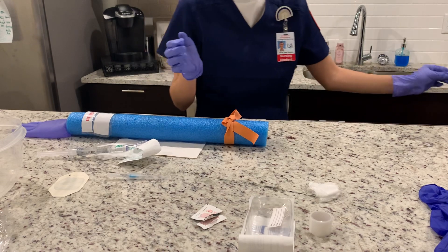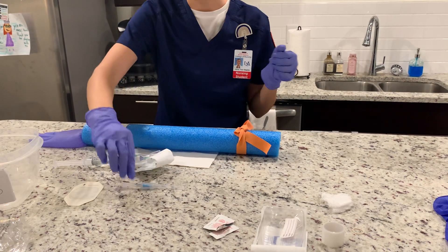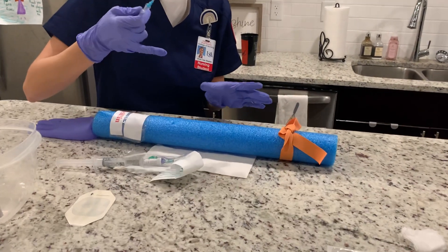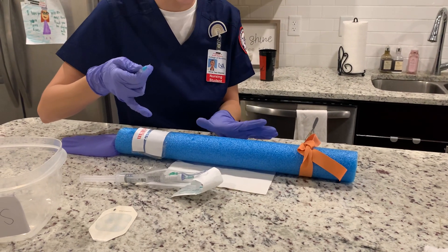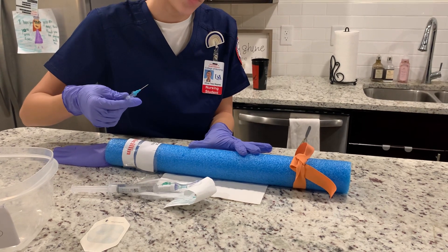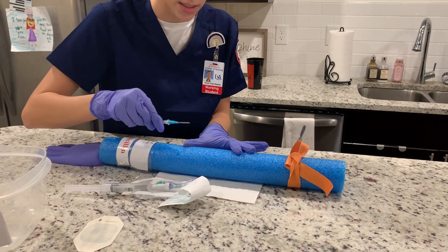Now I'm going to discard that and make sure the area dries completely. I'm going to take my needle, anchor down the vein about one and a half to two inches below where I plan to insert, making sure I don't go over where I just cleaned. I'll anchor it by stretching the vein, tell my patient to remain still, and that they would feel a slight pinch. I'm going to insert the needle with the bevel upwards at a 10 to 30 degree angle parallel to the vein.